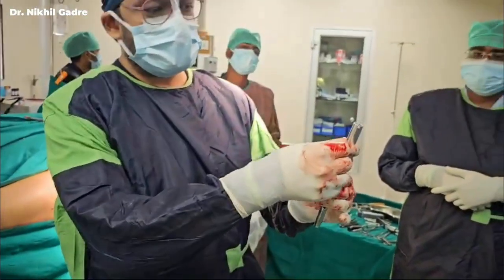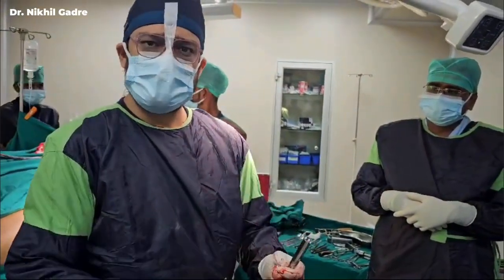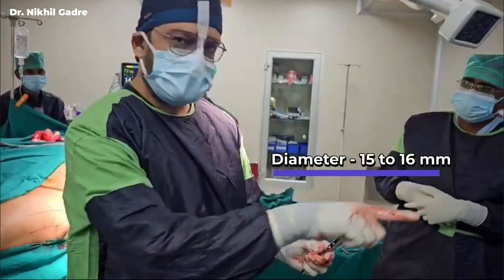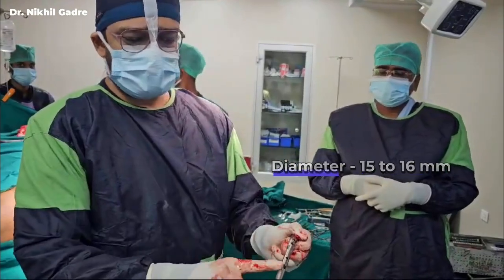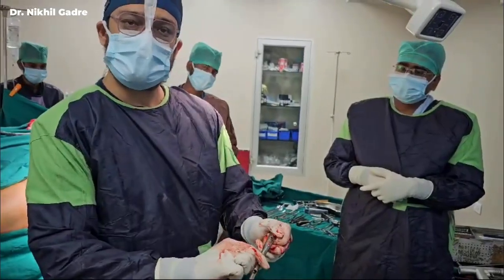This is a standard trochanteric femoral nail. This is the proximal portion of the nail. This is the distal portion of the nail. The proximal portion of the nail has a standard diameter. It is around 15 to 16 mm, which is the same for all the nails of all the sizes. Only the distal diameter differs, whether it's 11, 12, 9, 10, only the distal diameter differs.